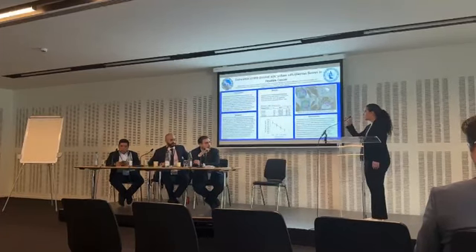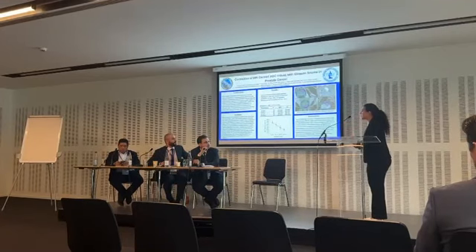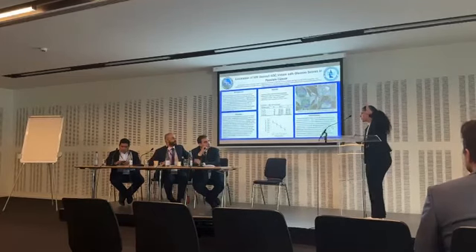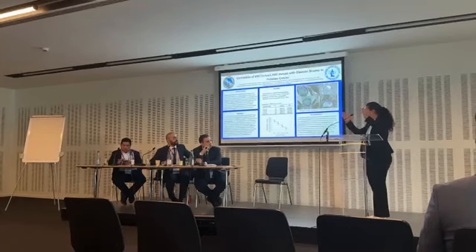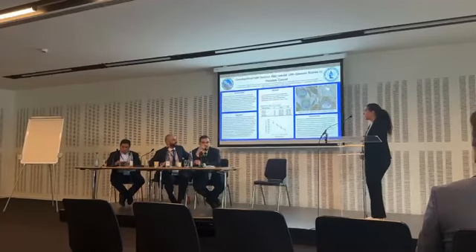Yes, so for example, F1, F2, F3. However, if there was a lesion that was 3+3 in the transitional zone, and then if there was an F1 that was somewhere else, since prostate cancer is multifocal, we would use those two as different lesions. That's why you see more lesions than patients.